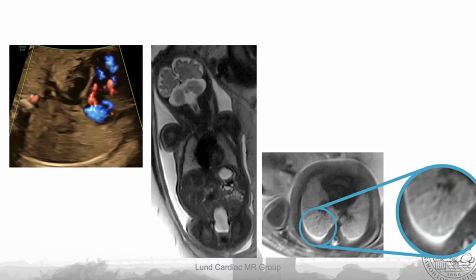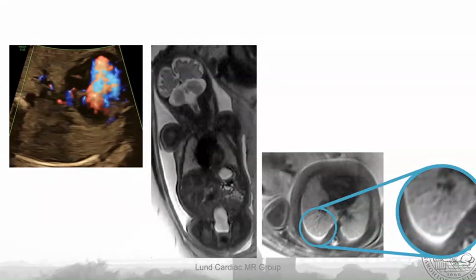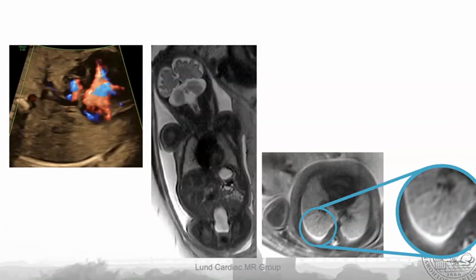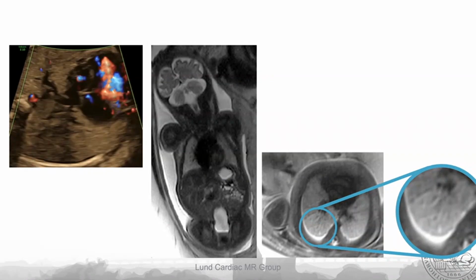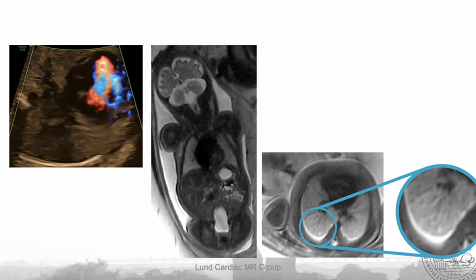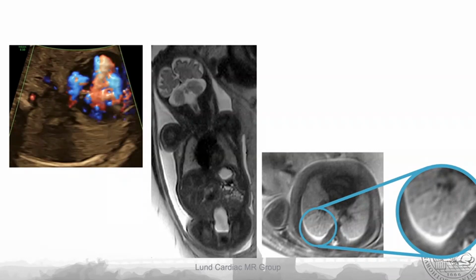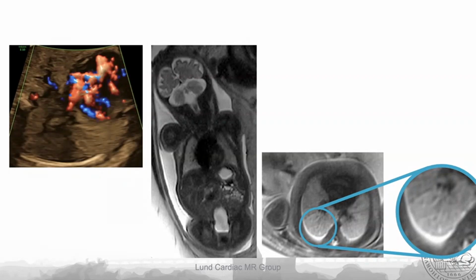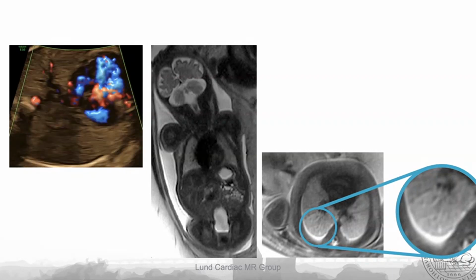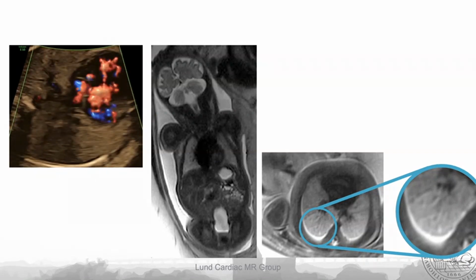And then we wanted the MR scan done, particularly for pleural and pericardial fluid, and the nutmeg pattern for lymphangiectasia. So even though we had all this information, it was planned for a vaginal delivery and a clinical assessment immediately thereafter, and then palliative care in this very challenging case. But again, the parents were more prepared than they otherwise had been, as also been discussed by others today.